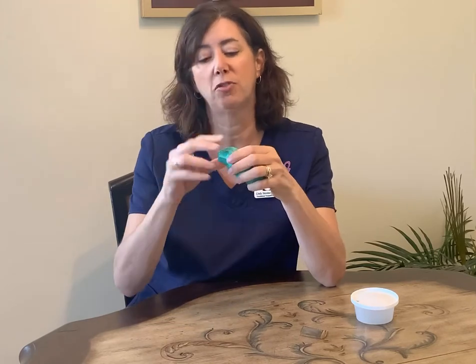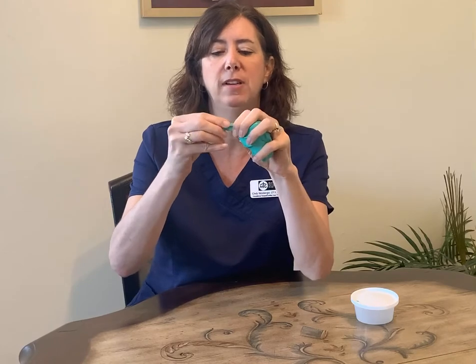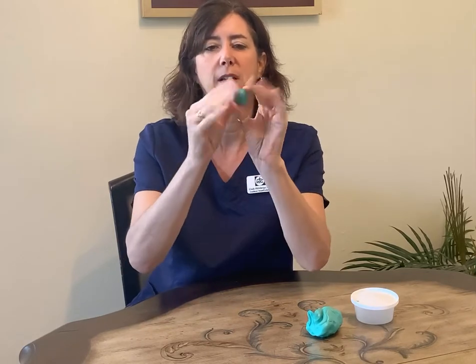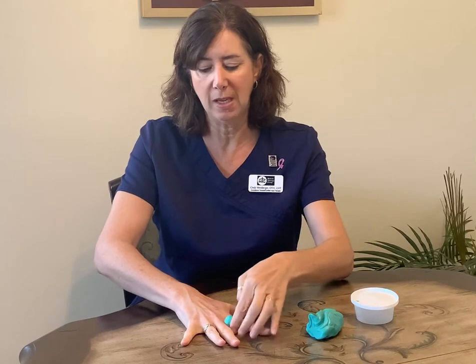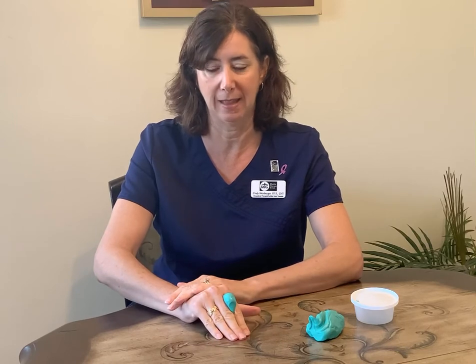Third one that I like, you have to pull off a ball of putty, which is a bit of a trick in itself. You have to make it really, really skinny and then yank it. So you get a small ball, like the size of a little rubber ball. Put your hand down flat on the table and you're going to squeeze the ball in between your fingers. Be sure to keep your hand flat. Don't let it pop up like that.